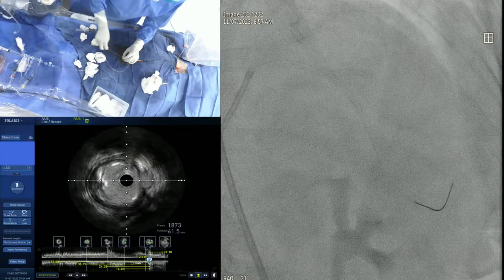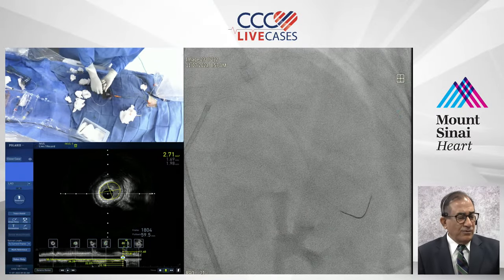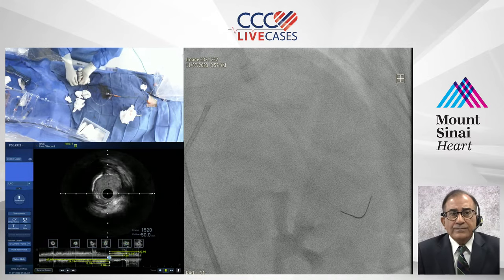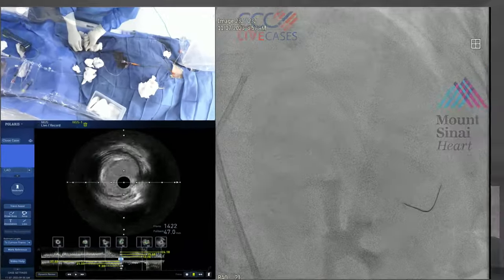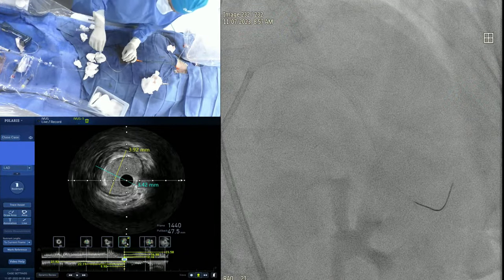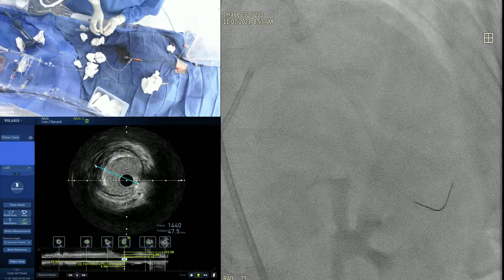Yeah. Anu, could you have also dilated the proximal with the same balloon to facilitate the placement of IVL? Oh, you're in the proximal area. No, no. Yeah, again, we'll go here. But you're right. If there would have been a tighter lesion, then it's the right approach, because you don't want to struggle with IVL. But in this one, we'll go.